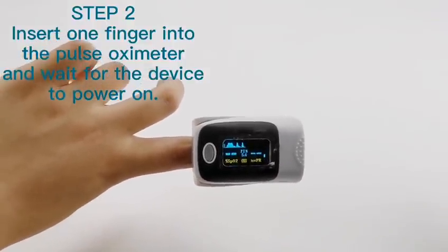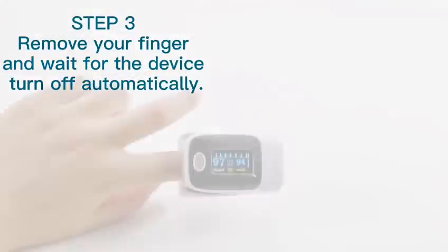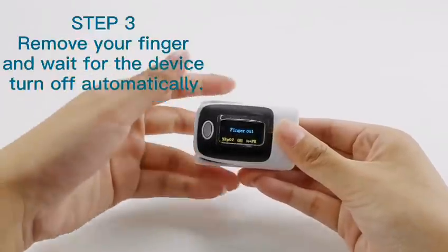After about 5 seconds, you will see the results. When finished, remove your finger and wait for the device to turn off automatically.